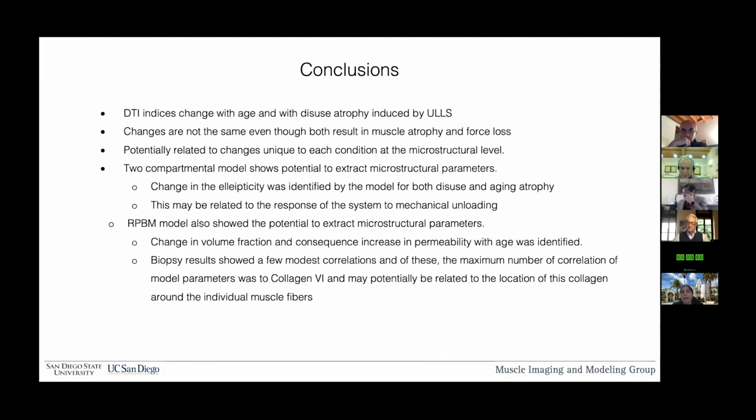Yes, we could, in the sense that if you knew the fibers and we were able to get the strain in the fiber cross section, because we do get the strain in the fiber cross section, but as he indicated, there's an angle between the maximum values of these strains and the fiber.